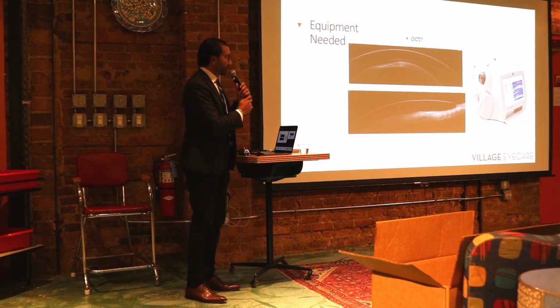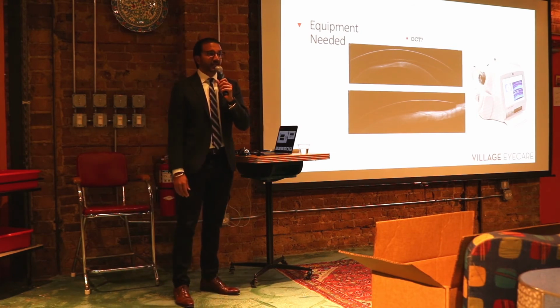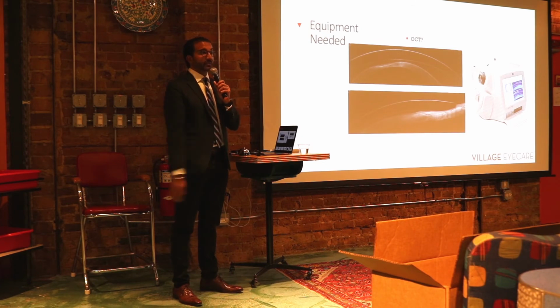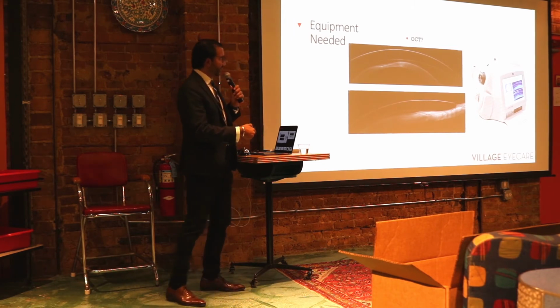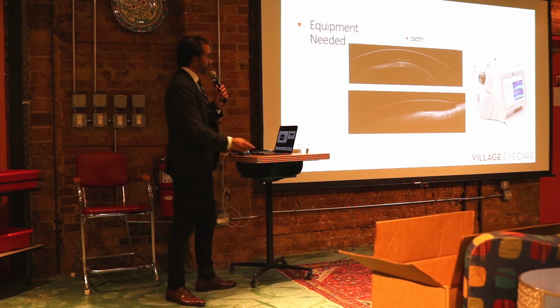The OCT is also becoming pretty prevalent in most optometric practices, more so for retinal and nerve diagnostic capabilities and scanning. However, a lot of the OCT devices with the right adapters can give excellent anterior segment scans. As you can see here, these are two images taken in our office. The top image is the scleral lens right here. Below that is the preservative-free saline, and then here's the irregular cornea right there. And so yes, this can be seen with a slit lamp, but not like this. Our technicians will take these images after the lenses settle for 30 minutes, they get added to the chart, and then we can measure with calipers how much room we have, and I'll discuss that later.